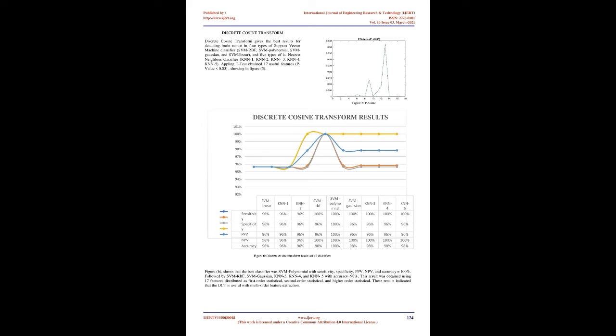Figure 2 illustrates the original image, A, and the final output image after performing skull stripping and threshold segmentation. Methodology.